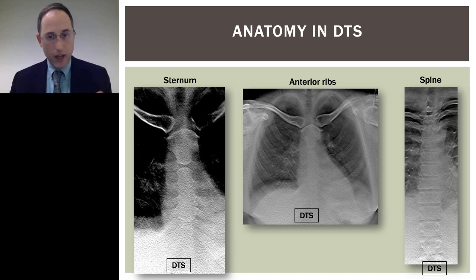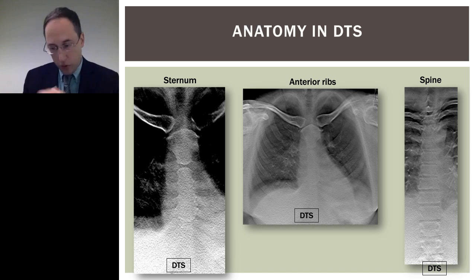So what does the anatomy look like? It is still a new modality, and a lot of people look at it and feel uncomfortable, a little confused, not sure exactly what their landmarks are. You can use your established knowledge in CT and radiography, but you still need to gain comfort. So let me just show some anatomy in tomosynthesis scans just to give you an idea of what things look like, because maybe you've never seen this before.